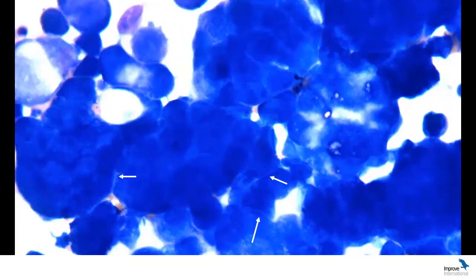It's because I'm trying to assess within these thicker clusters how these cells are interacting with each other. I hope you can appreciate, in the arrowed areas, the fine white lines between the cells. This is a typical thing that can assign this to an epithelial population: this well-defined cell-to-cell border that we often call the tight junctions between the epithelium.